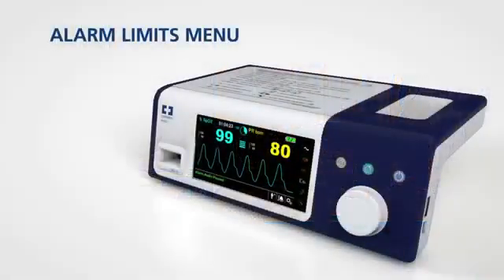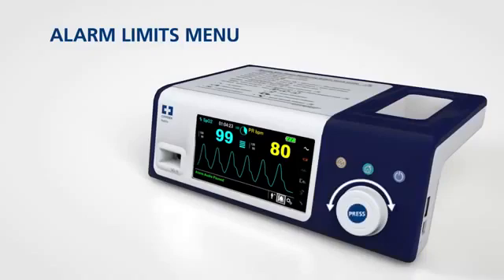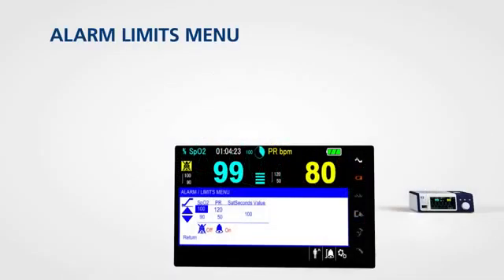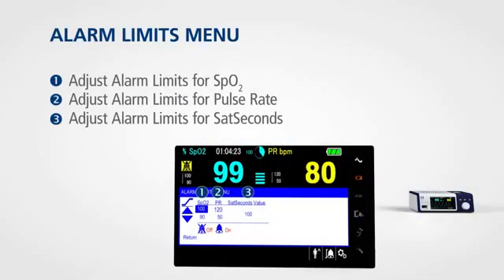To access the alarm limits menu for SPO2, pulse rate, and sat seconds, rotate the jog dial to highlight the alarm limits display area and press. The sat seconds alarm menu allows you to adjust settings to minimize clinically insignificant alarms that occur with your patient.